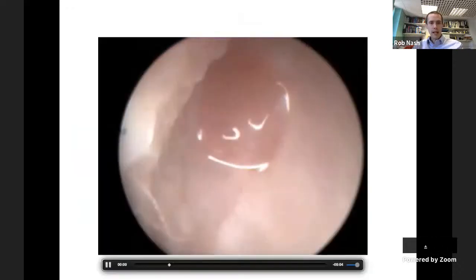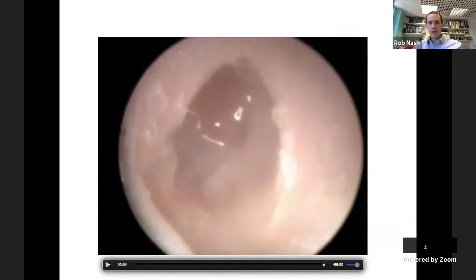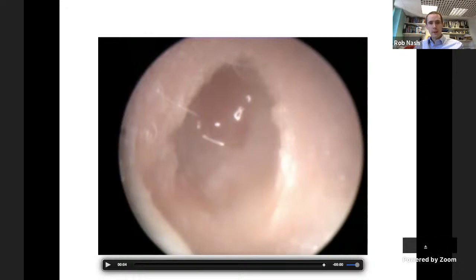This child has severe infection in the ear with a polyp - you're not going to be able to see anything at all. You can try to remove the polyp, treat topically with steroid and antibiotic drops and hope it resolves, but if it doesn't go away, you'll need to arrange imaging because the diagnosis is not clear.